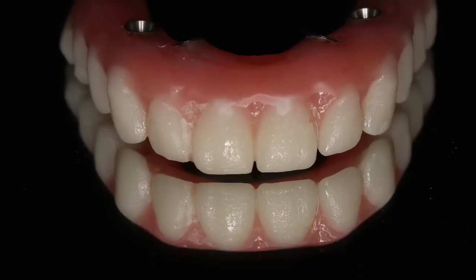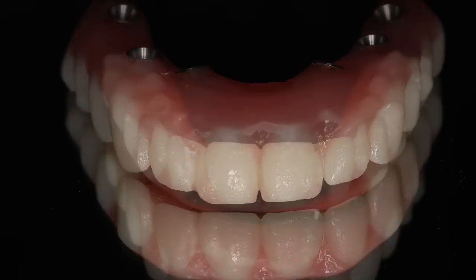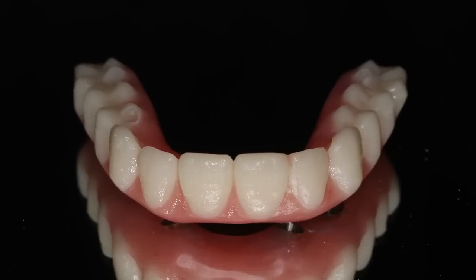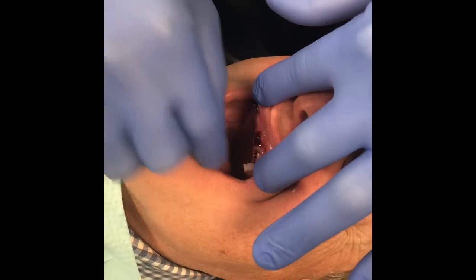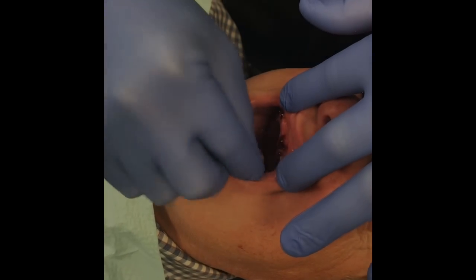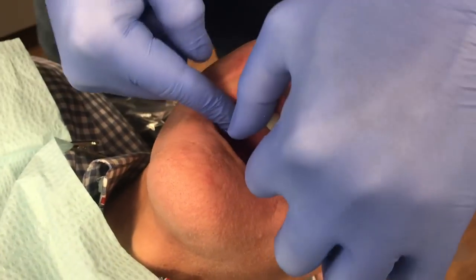Then we take it to the polishing wheel and polish it ready for delivery to the patient. Here you see that we didn't have to destroy the occlusal anatomy in our pickup procedure. So then we remove the plastic protective caps, and that's unscrewing the threaded post that remained in the multi-unit.